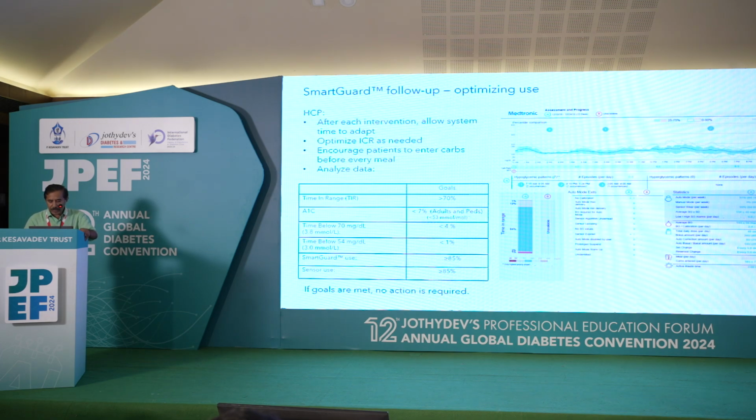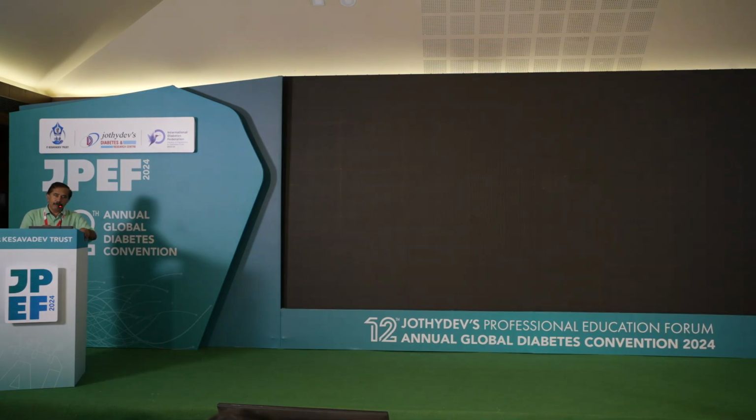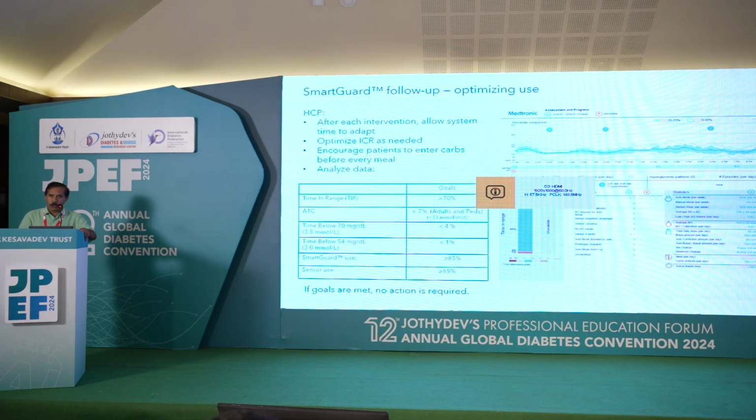During follow-up, from the Carelink data, we get a lot of information and we need to look at it. What Dr. Vinay was explaining is that there are multiple things happening. There is always an auto basal which is on. Even if someone misses a meal bolus, there can be extra boluses or correction boluses delivered by the pump, along with an increase in the basal secretion. All of that boils down to bringing the time in range to the recommended level, which is 70% or more than 70%. So that is very encouraging.